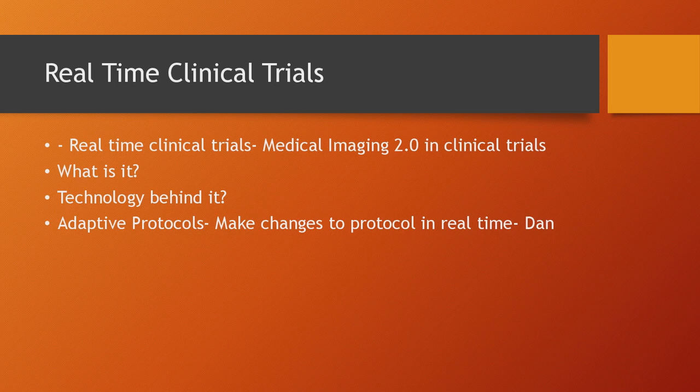Okay, so I think this is the real-time clinical trials concept. At any time of the study, we can enter into the platform, we can see the results of the analysis in all patients, and we can help to undertake decisions related to the clinical trial.